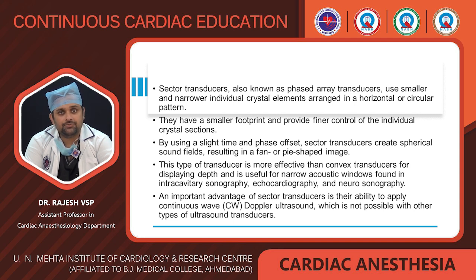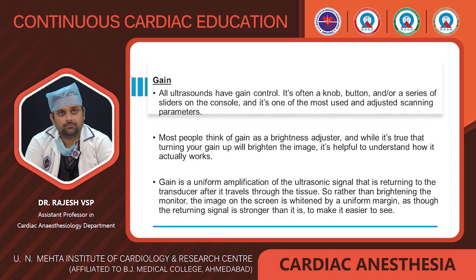This type of transducer is more effective than convex transducers for displaying depth and is useful for narrow acoustic windows found in intracavitary sonography, echocardiography, and neurosonography. An important advantage of sector transducers is their ability to apply continuous wave Doppler ultrasound, which is not possible with other types of ultrasound transducers.